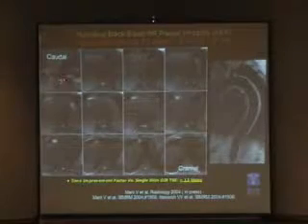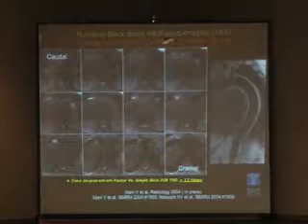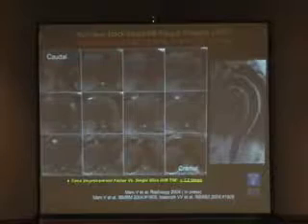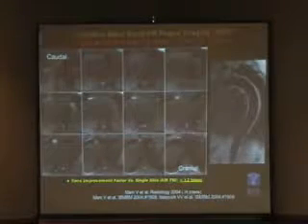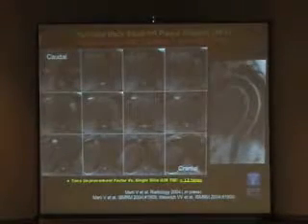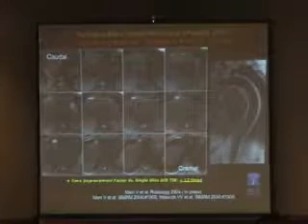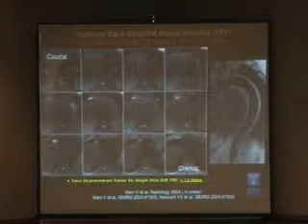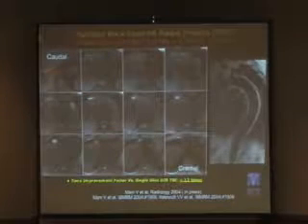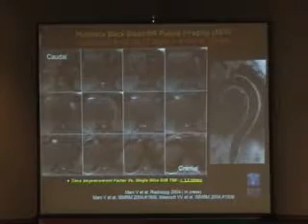And if you want to combine this with cross-sectional images to obtain quantitative volume of plaque, you can obtain 12 slices in less than 3 minutes. So the whole thing can be done in 15 minutes, including the preparation of the patient. So you have to look at this very critically and not just brush it off, saying, oh, well, it's complicated and it takes a lot of time to do. Especially with recent advances in imaging, a lot of what you may be seeing in the literature that we or others published 5 years ago, now we can do 10 times faster. It didn't stop there and will not stop there.